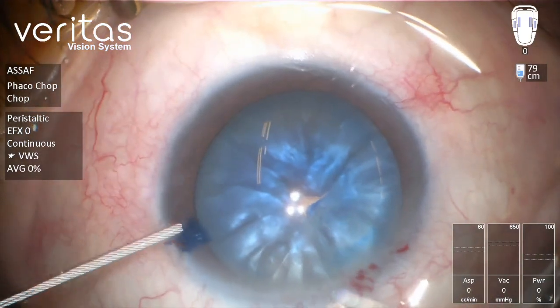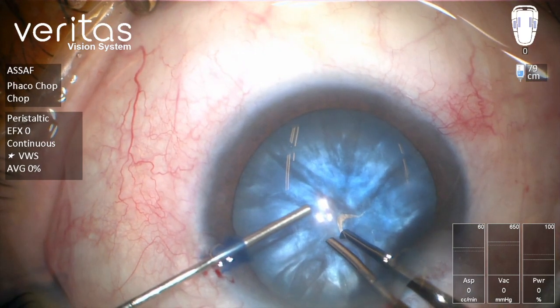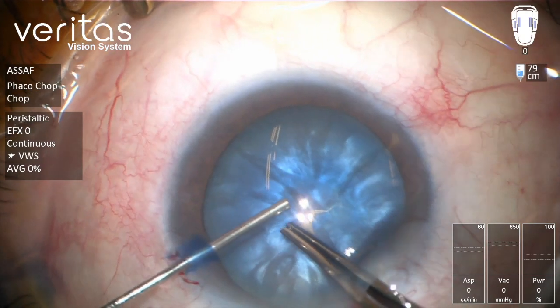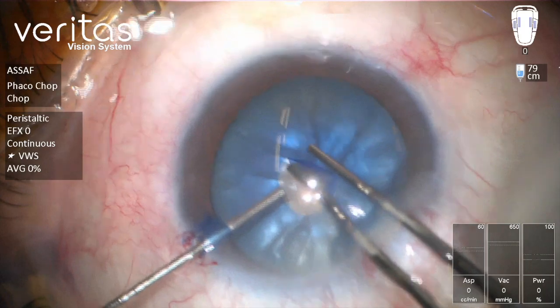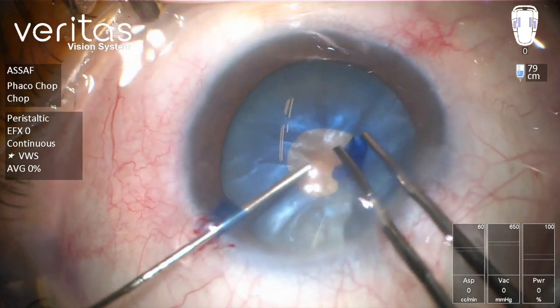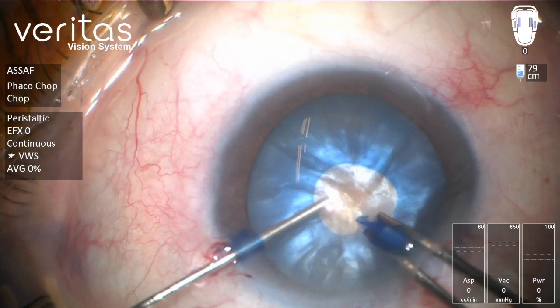Basically, you are going to start by creating a small rhexis — a kind of mini rhexis — then I'm going to enlarge this rhexis when we have some confidence in the direction of the tear. As you can see, this is intentionally a small rhexis, and then we can enlarge it in a spiral fashion.